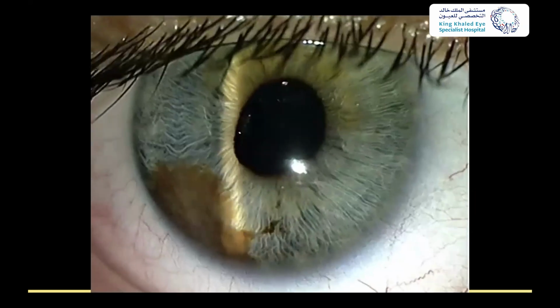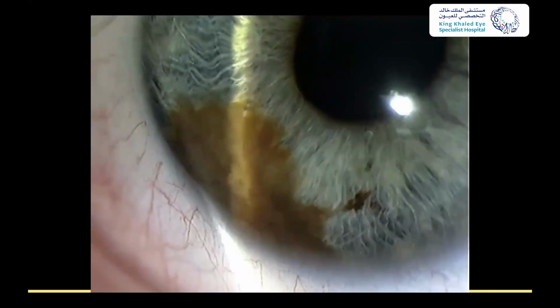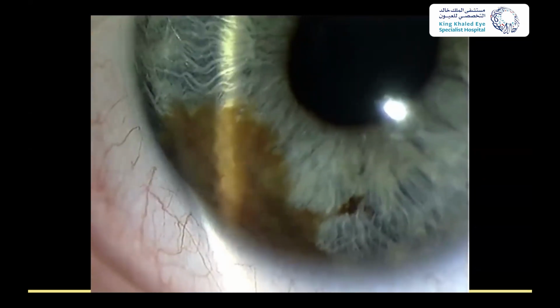And Axenfeld-Rieger syndrome with a prominent ring in the peripheral cornea that Dr. Edward and I have proven is not Schwalbe line. And lastly, there's just this 17-year-old girl with what looks like a scary lesion on her iris that on gonioscopy looks even scarier.